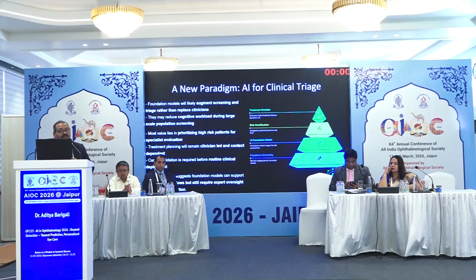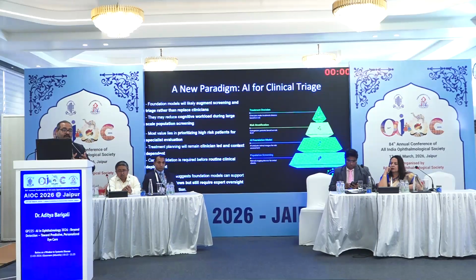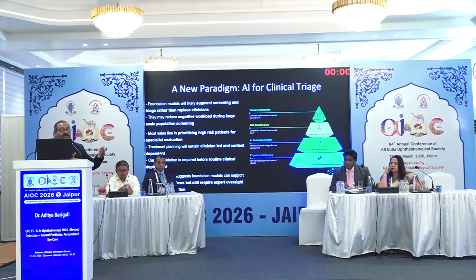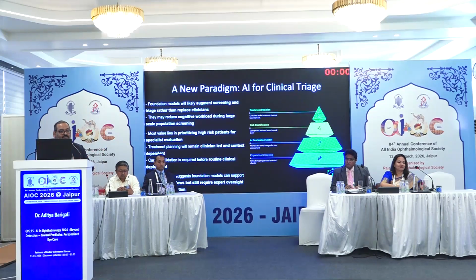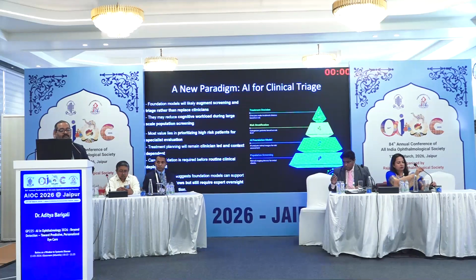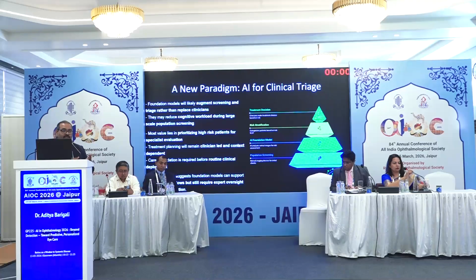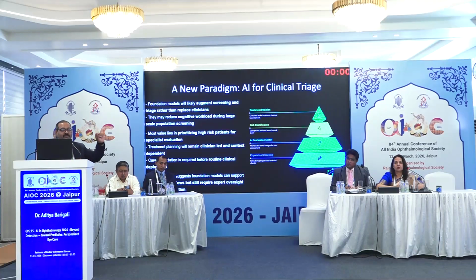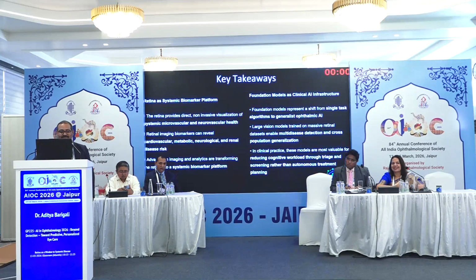Careful validation is required before routine clinical deployment because the AI is built over a very large generalized model. So it passes the exam, but it's not very accurate. It doesn't get first rank. The current evidence suggests that these foundational models can support diagnostic workflows, but they still require expert oversight and clinical validation. In engineering terms, it is called HITL, human in the loop. So essentially, there is a guy passing chits in the exam through the window. That is what human in the loop is doing for AI.